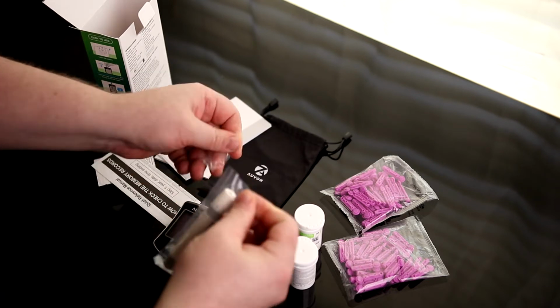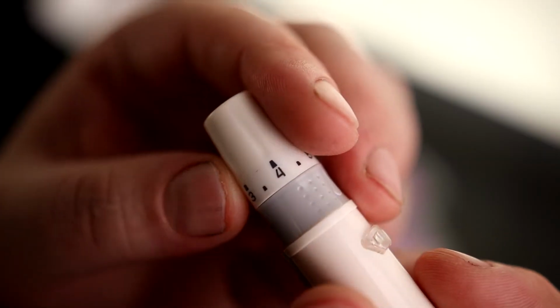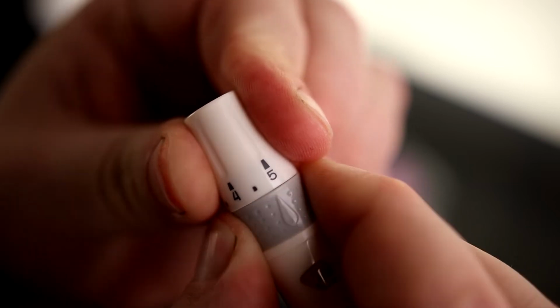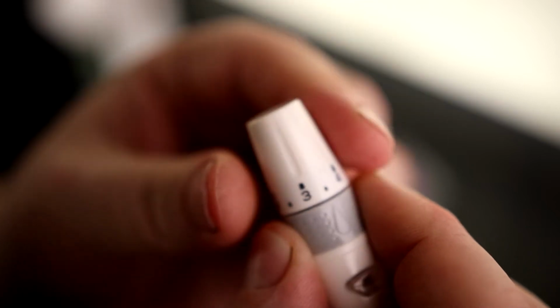And I've already used one of these, so I already know what to do. Essentially, we are going to take out our lancer. Right here, we can set the depth. You can see we got our pointer right here. So if you got thick skin, you might want to set it to a 5. If you got thinner skin, you can set it lower than that.